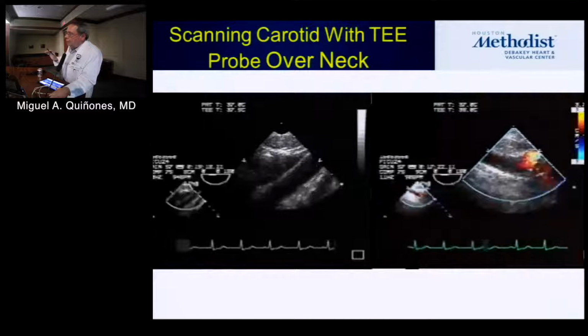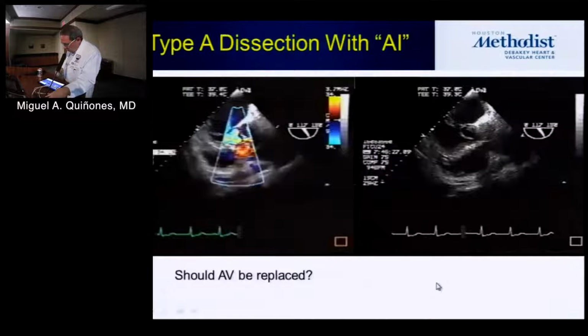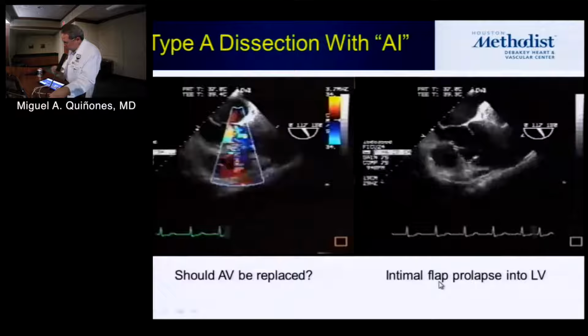All right, so there's a lot of color there. Looks like a lot of AI. But the question is why? So, what do you all think? Jeff, what do you think is the cause of the AI there? Of what?